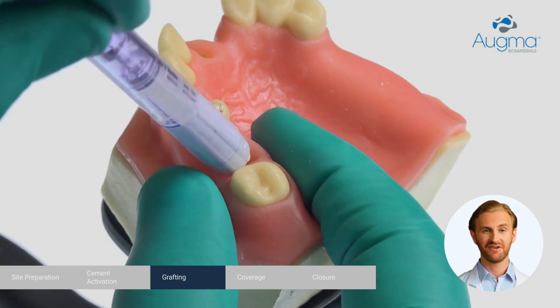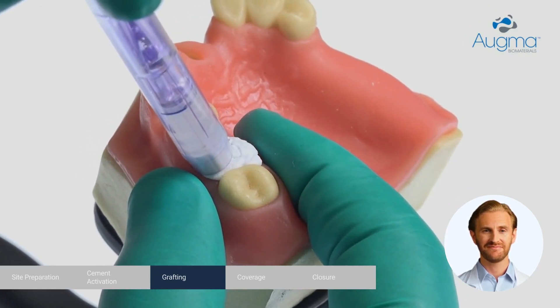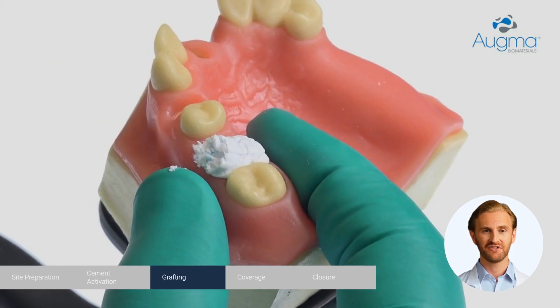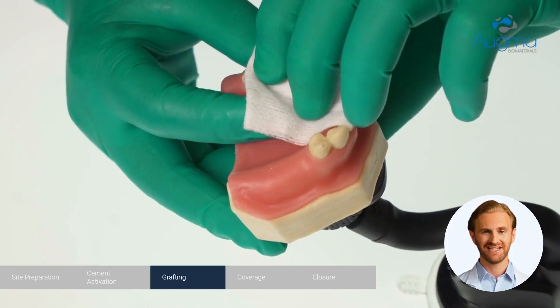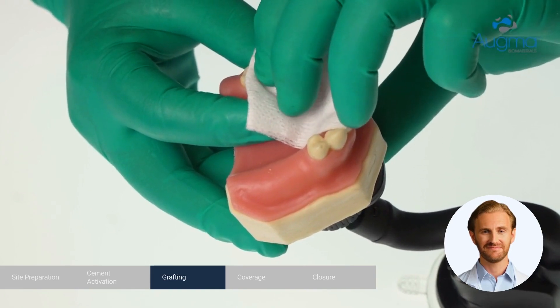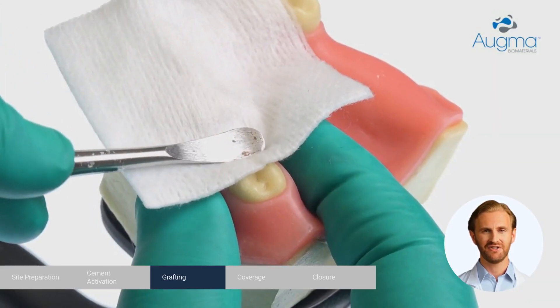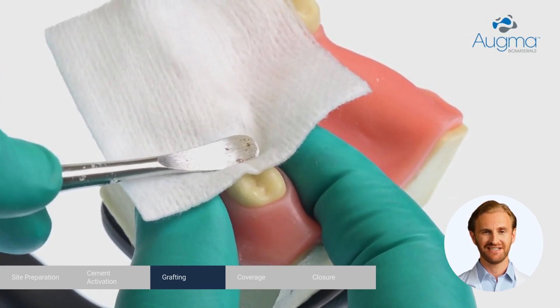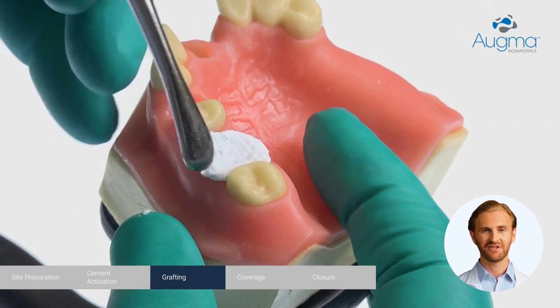Eject the material into the socket at a 45-degree angle and slightly overfill. Take a dry, unfolded, sterile gauze and press strongly with a finger for 3 seconds. Use the periosteal elevator and add compaction on the material for an additional 3 seconds. Remove excess material.